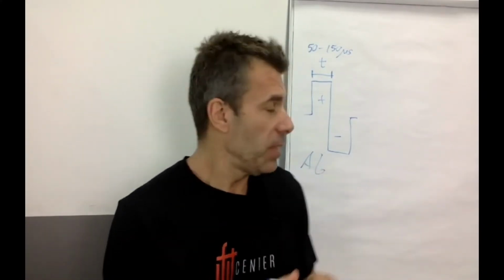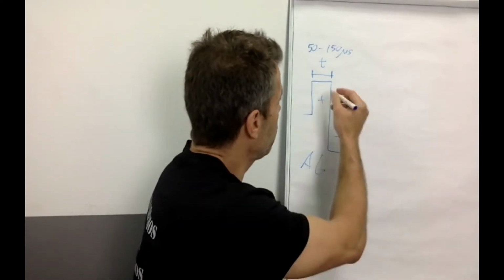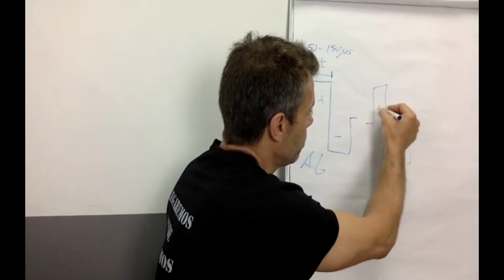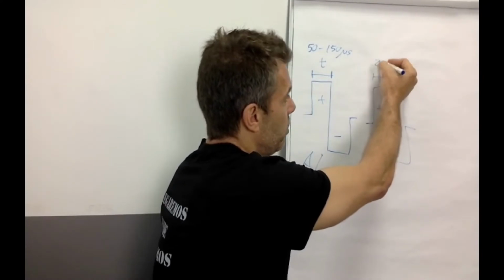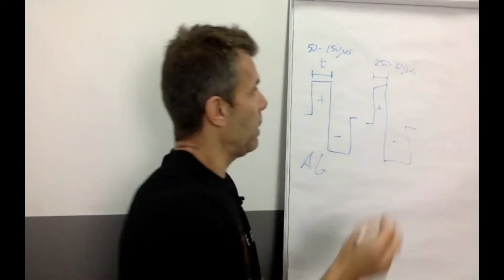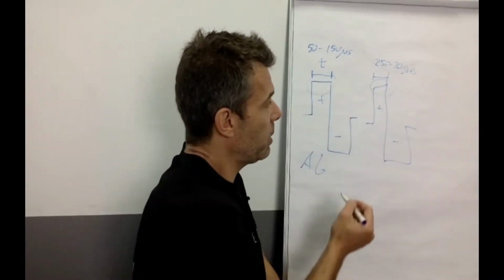What happens when we want to stimulate the muscle? Well, we have to stimulate a different type of fiber. We're going to stimulate the alpha motor neurons. So those require much longer stimulation time, okay? We're talking about the crucial stimulation time when we precisely apply either a positive or a negative electrical pulse. This time is generally going to be specifically between 250 and 350 microseconds, okay? This precise duration is vital for the intended effect. So that impulse can last 4, 5, or even 6 times longer. So you can stimulate this fiber without stimulating the other one, okay?